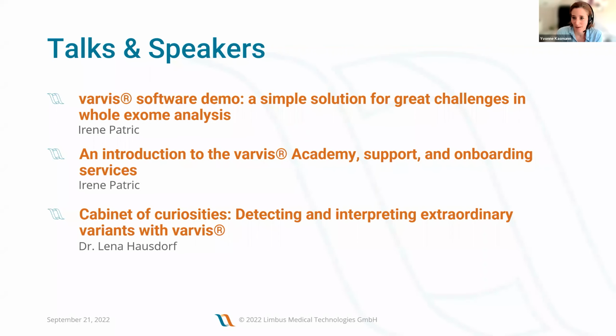And finally, we have Lena on board, who's the head of service at Limbus here, and she will present some very interesting, extraordinary variants and how you can detect and interpret them with the help of varvis.